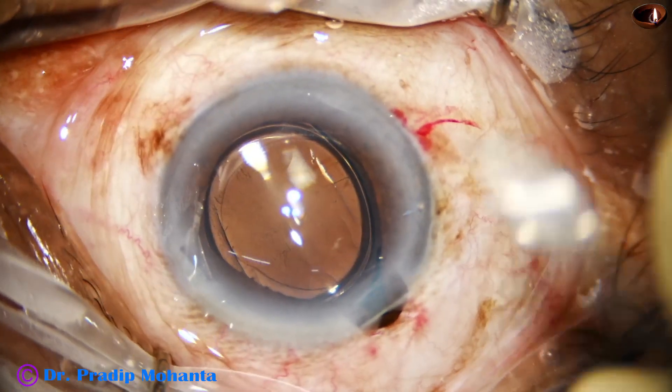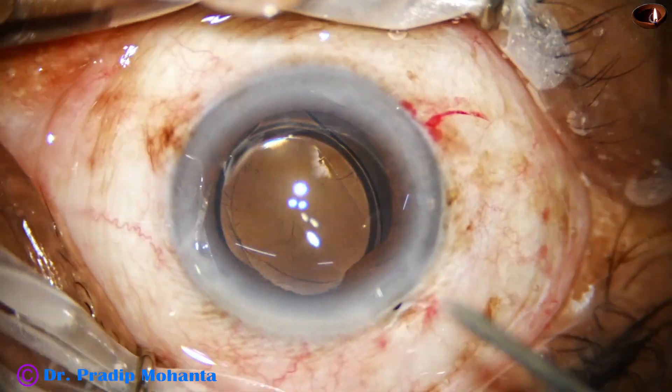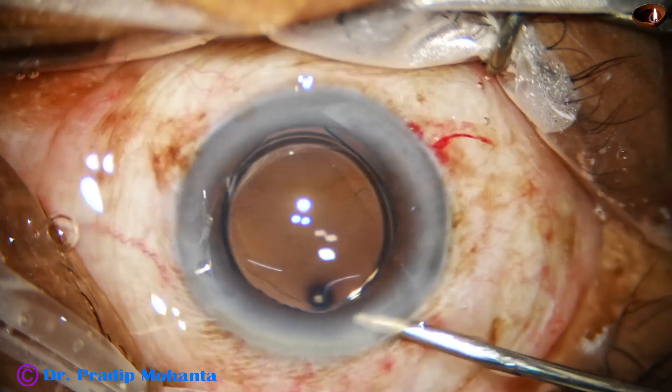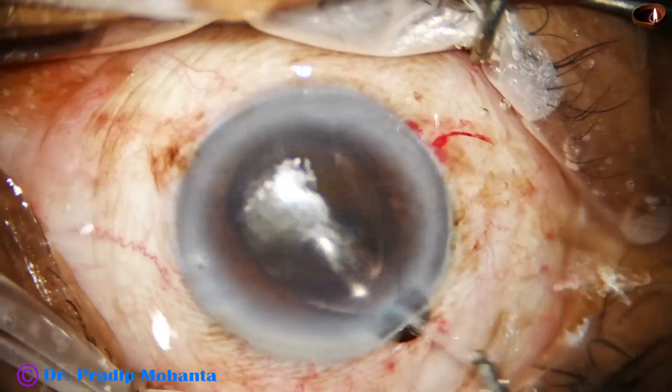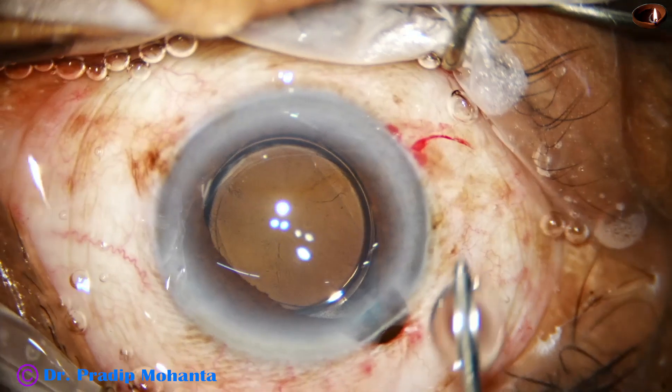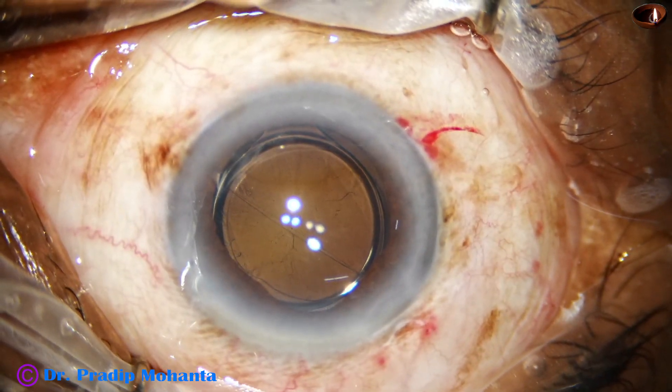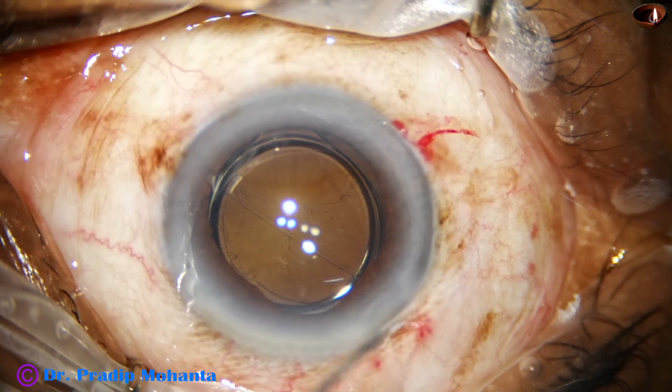Again some prolapse of the iris through the main wound, so we have to use the main wound less. Whenever we try to reposition the iris we must stop irrigation and then push the iris back.